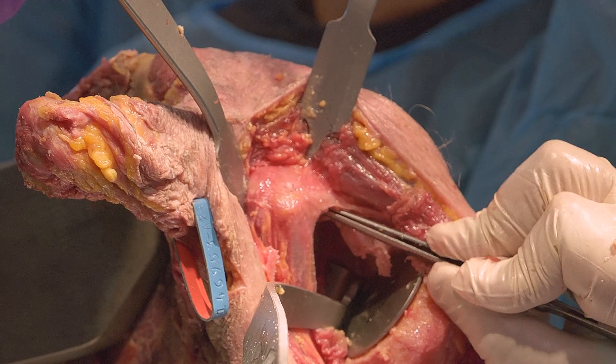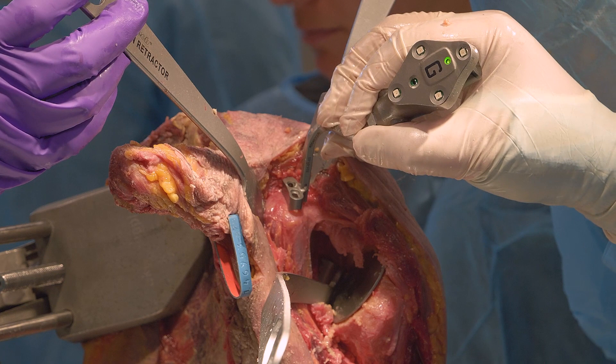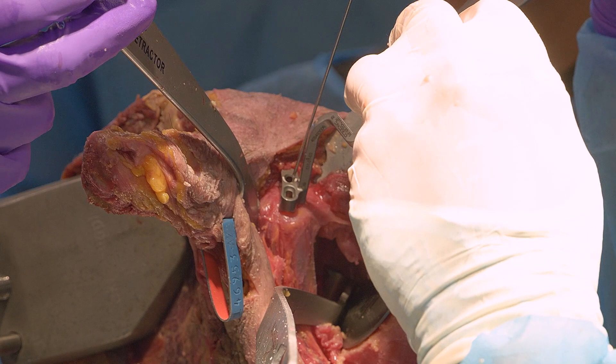I am pointing at the anterior aspect of the coracoid base. This is where I'll be starting my medial screw for the coracoid block, which makes it easier to identify with adequate coracoid base exposure. As a surgical tip, you can aim the coracoid tracker towards the GPS unit to help improve visibility of the tracker. You just need to ensure that the medial coracoid pin is aiming towards the coracoid base to get adequate fixation.